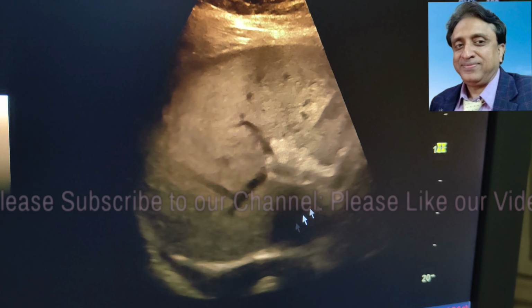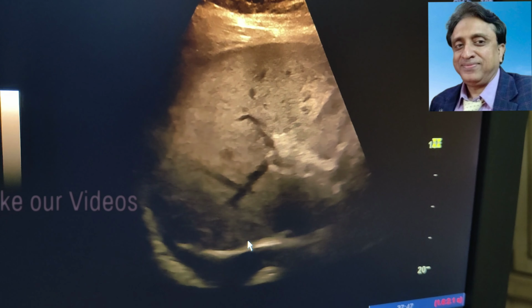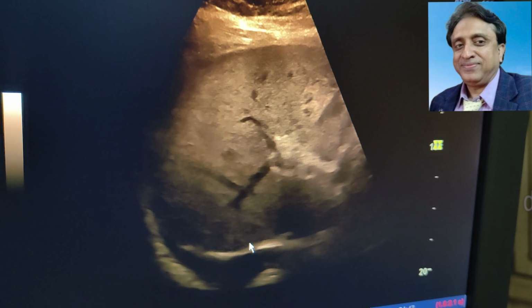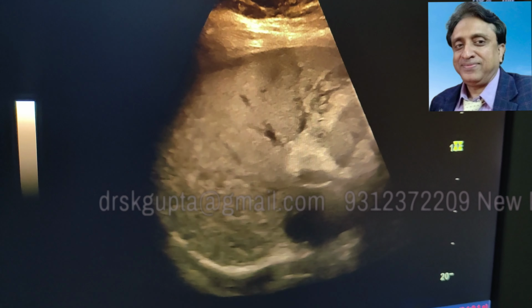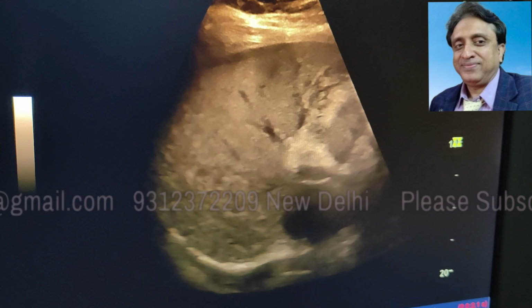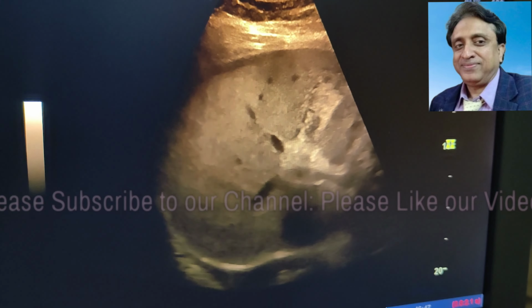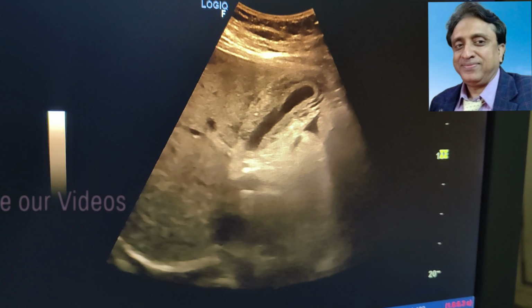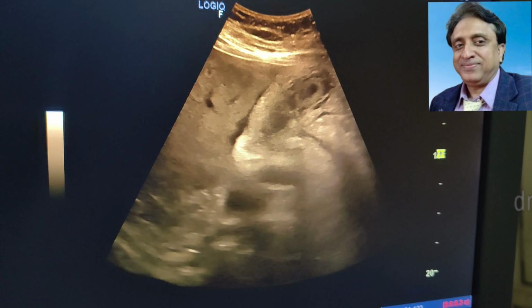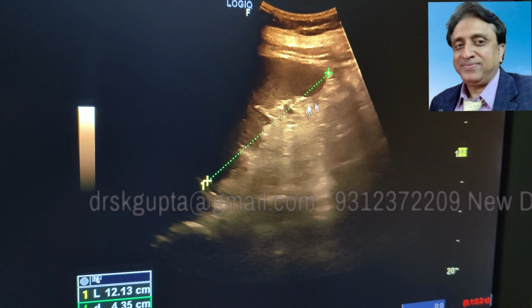Here the liver parenchyma does not show decreased echogenicity, but the echogenicity of the liver might be decreased because the liver is involved in dengue fever and hepatitis occurs. But in obese patients or patients who already have fatty liver, this decrease in echogenicity may be difficult to ascertain. In a good number of patients the liver may be increased in size, but here the liver size is nearly normal. Coming to the spleen, you can see that the spleen size is increased.